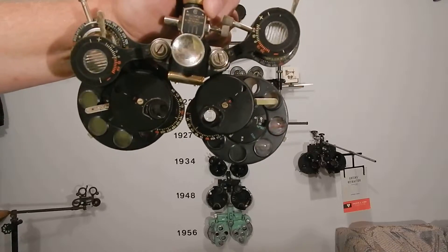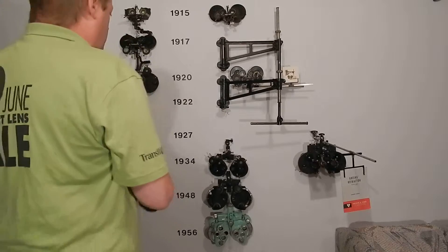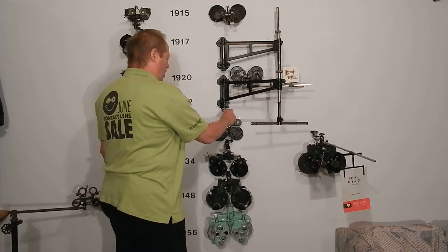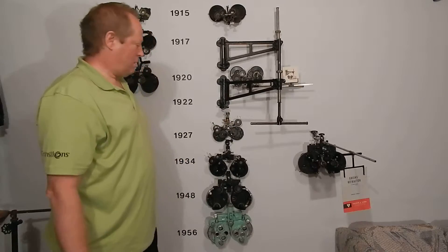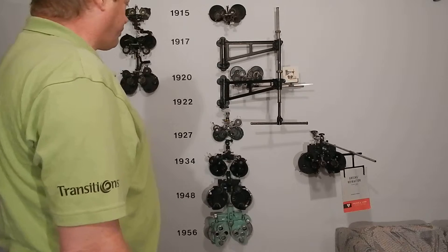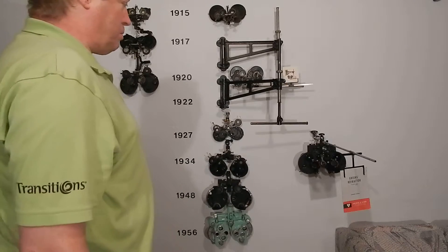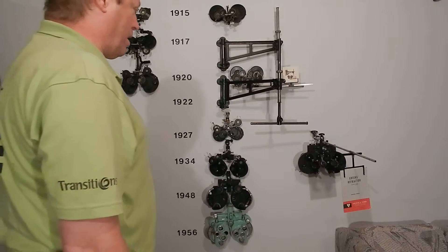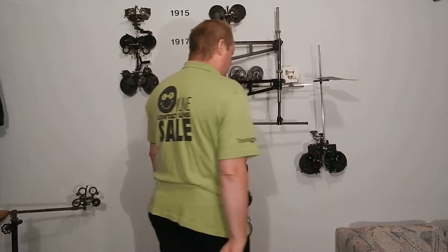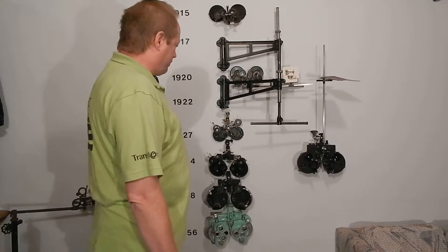Opticians never bought eighth-diopter lenses. Even if an optometrist prescribed an eighth-diopter prescription, the optician would say, 'Which way do you want me to go — up or down? I don't have 1.88.' Right after that, some bad news was coming: probably the best phoropter ever made was about to come out. This one has a Stevens phorometer on it, so American Optical quickly retooled.